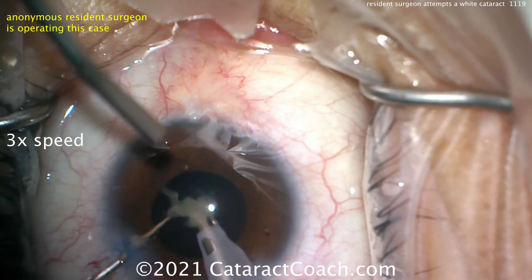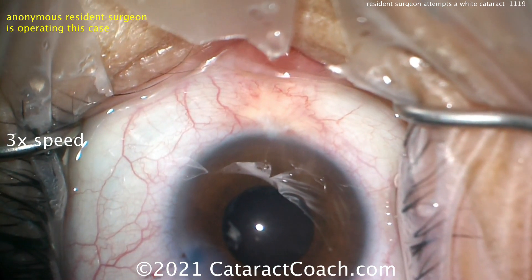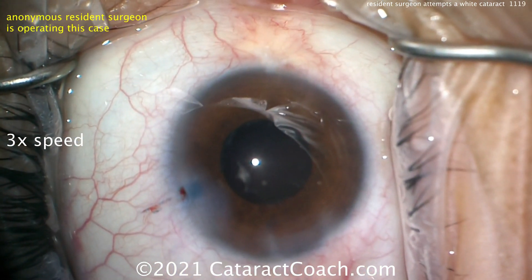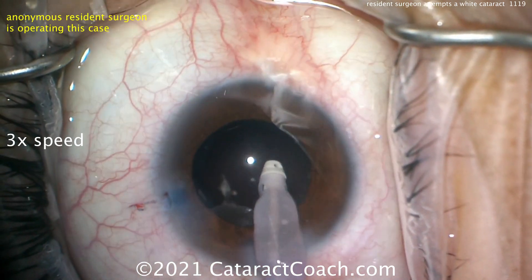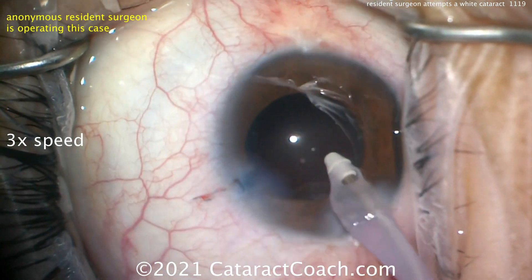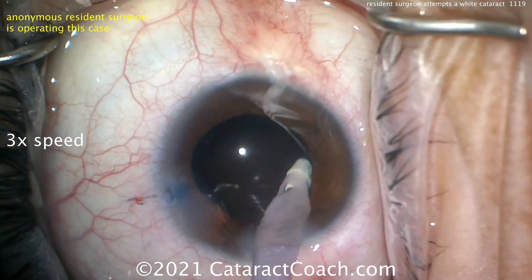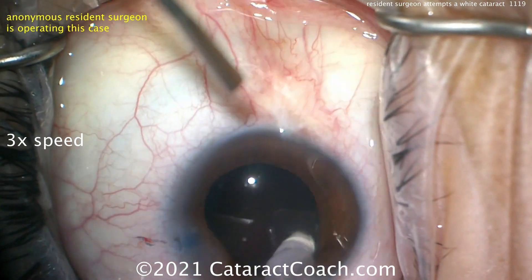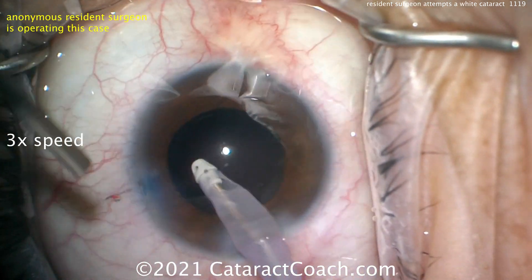There's not much of a red reflex, and that's probably because of the microscope light settings. Look at the cornea — there's one light reflex, which is the paraxial light. You need to also have the coaxial illumination. I can tell you this is a Zeiss microscope, and it should have three lights: two coaxial and one paraxial. The poor red reflex is due to that. There could also be other reasons — if you have poor Zinn support, trypan blue dye could have gone back into the vitreous cavity, which can also diminish the red reflex. But I think it's mainly the lighting, because you can see only one light reflex on that first Purkinje image.